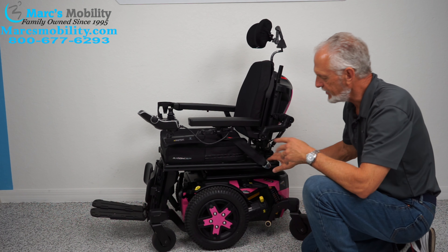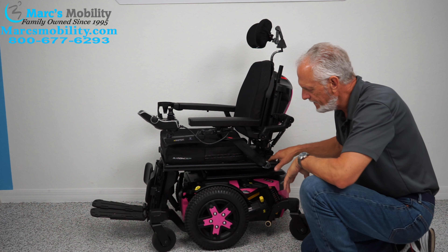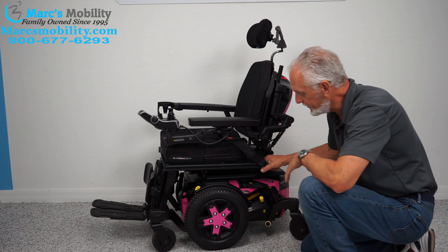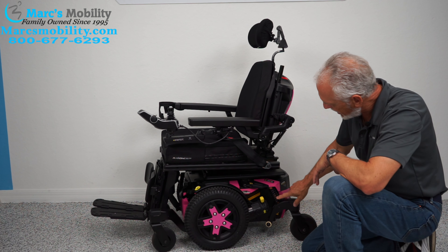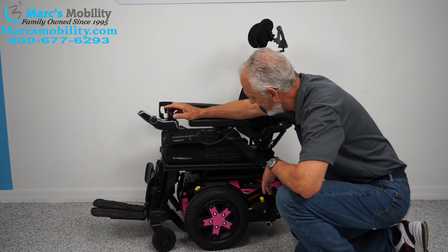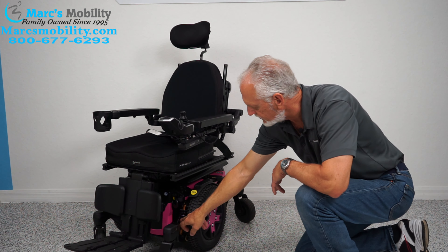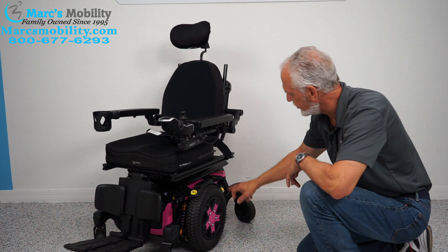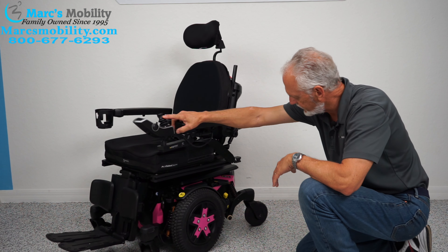This chair weighs about 375 pounds — it's all metal, a pretty heavy power chair. You can see the shock here for the back and the same shock in front. You have four of these shocks, which is why these chairs have such great suspension.